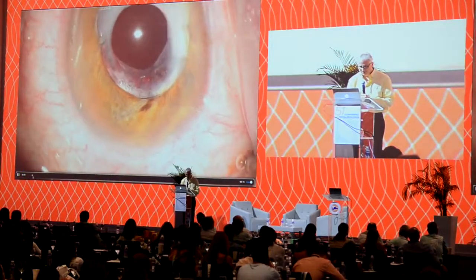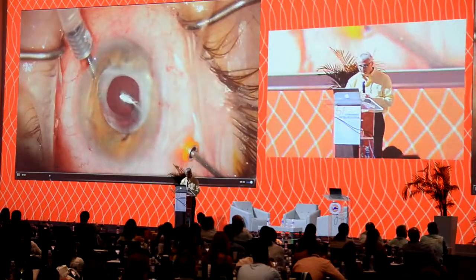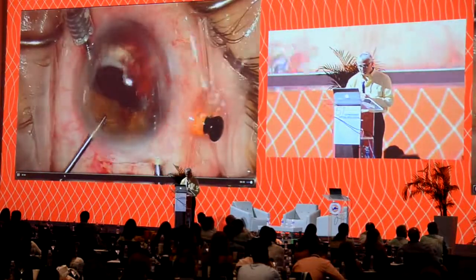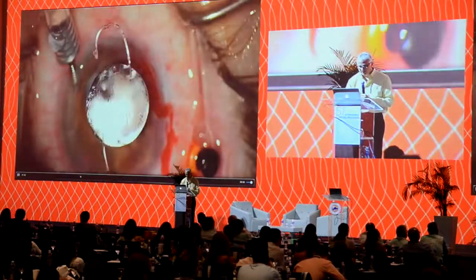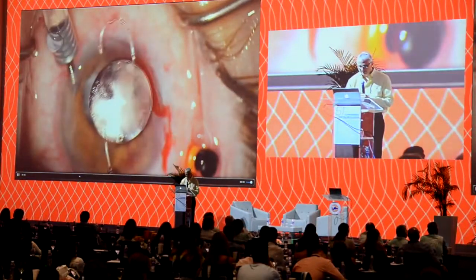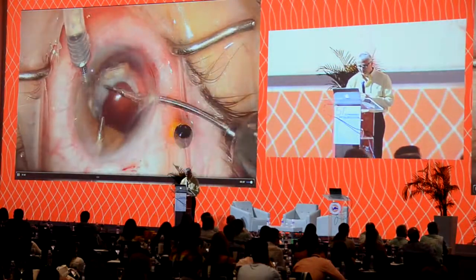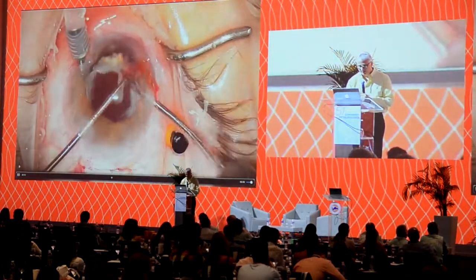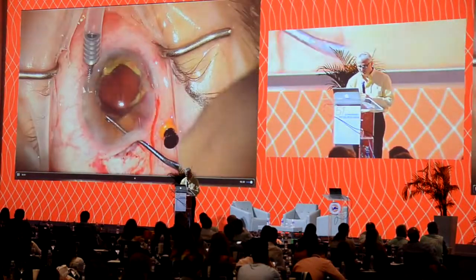Again, I just love looking and seeing the implant lens power. It's so convenient. We did a limited vitrectomy, which we've spoken about yesterday. Dissected out the firm haptics of the implant lens. That's what it looks like. Again, it's still 19.5. And then we carved a little bit of that thick rind of capsule so that we'd be able to capture an optic. We made it roughly 6 by 4.5 millimeter aperture.